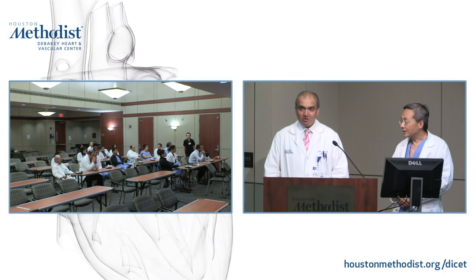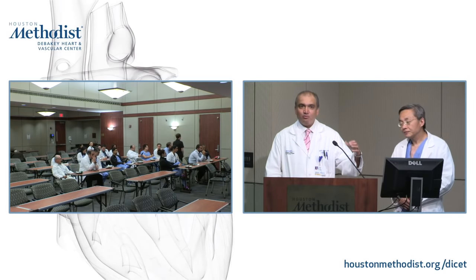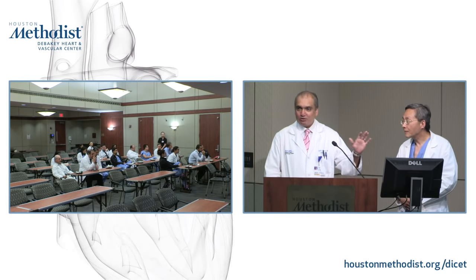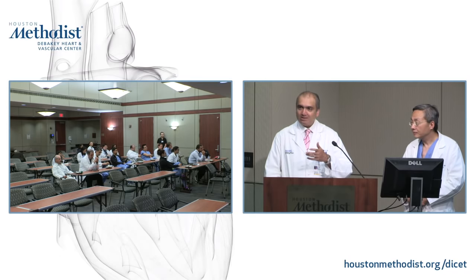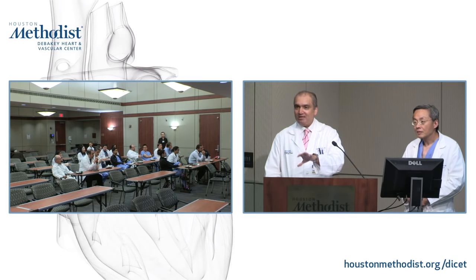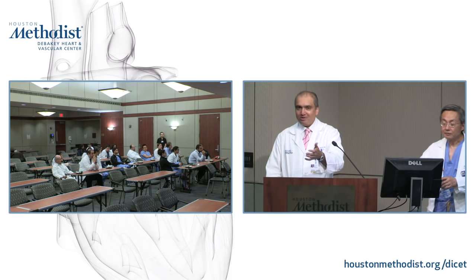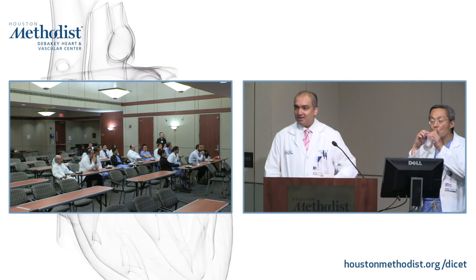Yeah, no, you don't have it. Maybe in the future, when you talk about 4D flow techniques and things like that. But none of those techniques have the resolution that you have with transesophageal echo. So, maybe Moaz can comment: in those cases where there's an index of suspicion for endocarditis, but your initial transesophageal echo is negative, is there a role for PET in that setting?